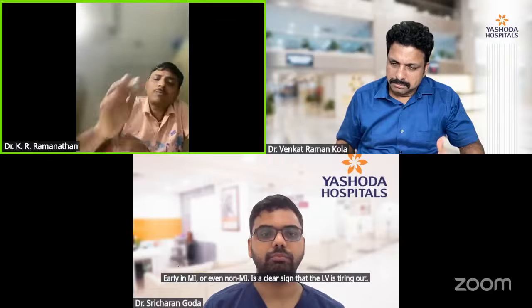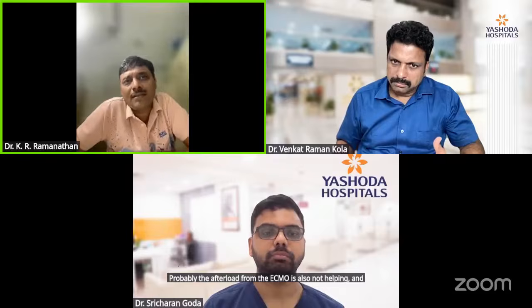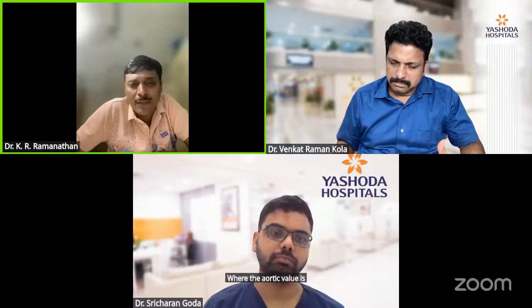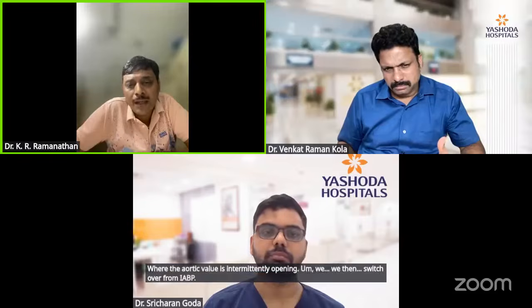Probably the afterload from the ECMO is also not helping. And once it reaches a stage where the aortic valve is only intermittently opening, we then switch over from IABP to Impella. So our second choice would be Impella in this context.